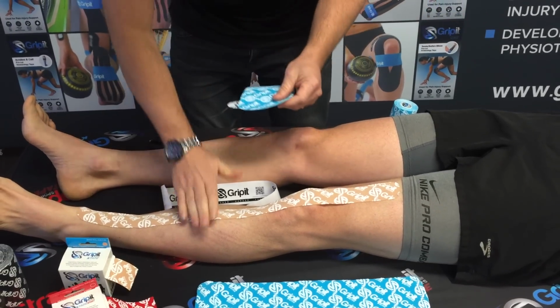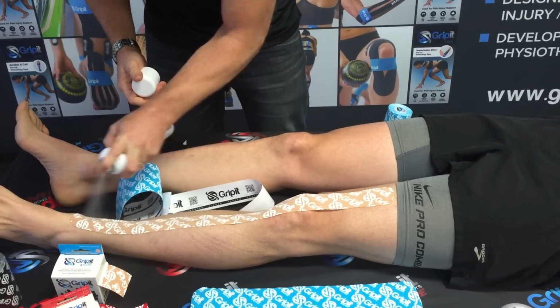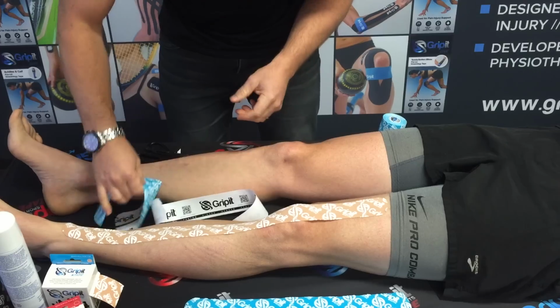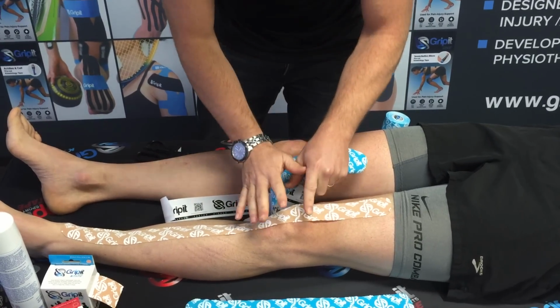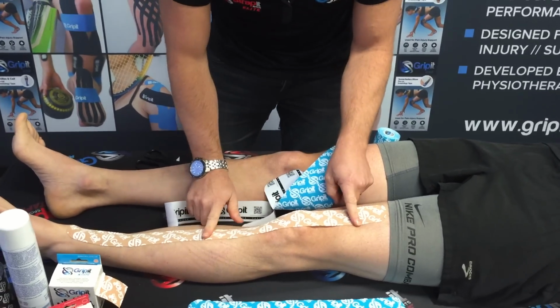Okay, so around the edges, between the layers, we might apply some spray, and that just makes the tape really stick to the other layer well. Now, if you've got a young child or someone who's quite light and you want to get some level of moderate offload or deload, this may be enough for you. Okay, so this 5 centimeter one strip could be enough.